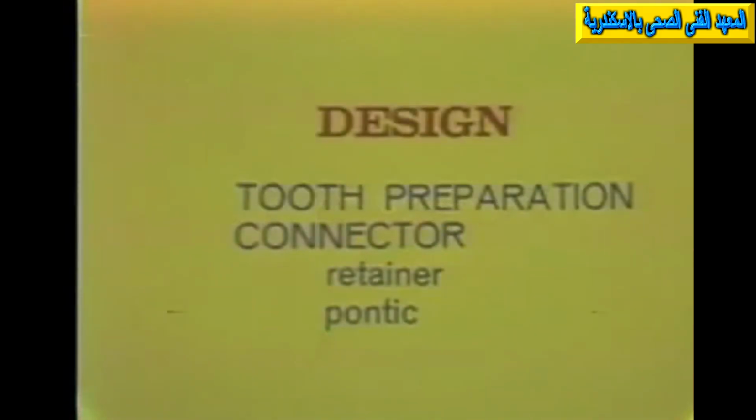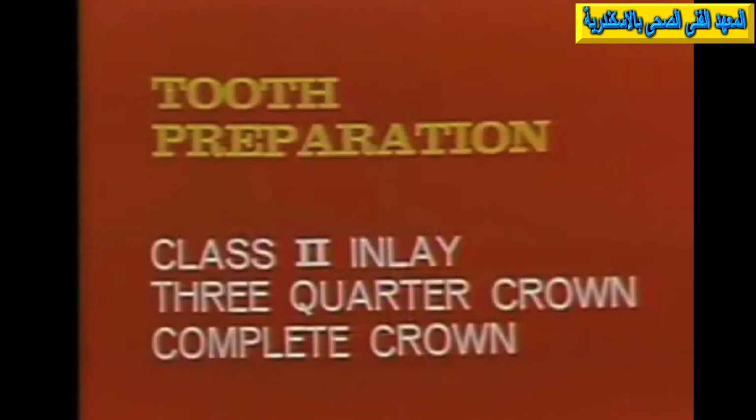Just to summarize the design and preparation of the semi-rigid connector, we have emphasized the need to begin the designing at the stage of the tooth preparation, and so far as the connector itself is concerned, it is the element in the retainer, the keyway, and the key, which is a part of the pontic. Just to go over the question of tooth preparation briefly, it can be used in class 2 inlays, in 3/4 crowns, and in complete crowns, and the important thing here is to make sure that a box of some type is available of sufficient size to receive the keyway when that has to be cut in the gold. So special attention is necessary then to tooth preparation.